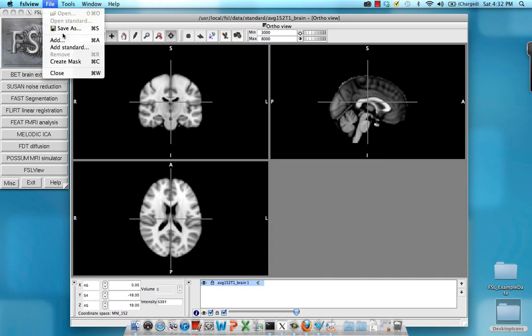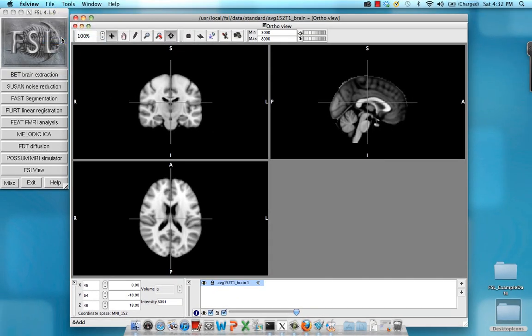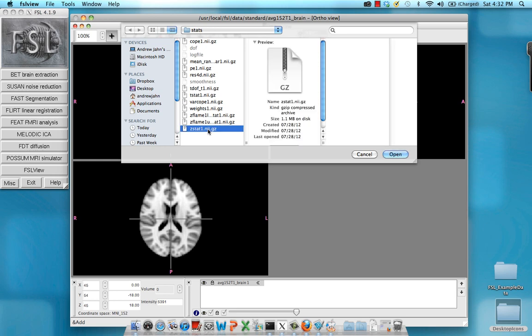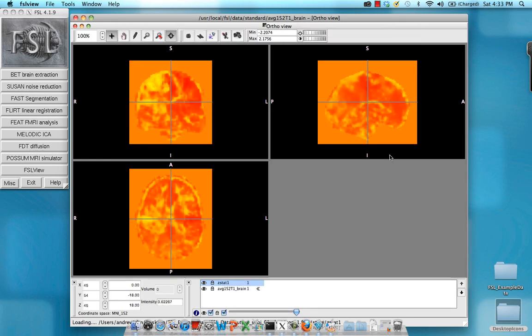So on top of this, I'm going to add my contrast estimate. So I'm already within cope one, which is contrast of left minus right. Within the stats, I'm going to select Zstat one dot NII and open it up.